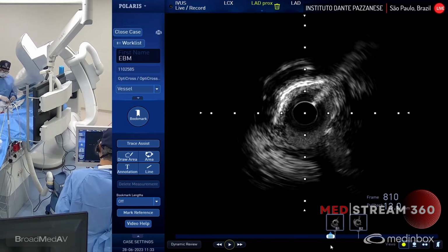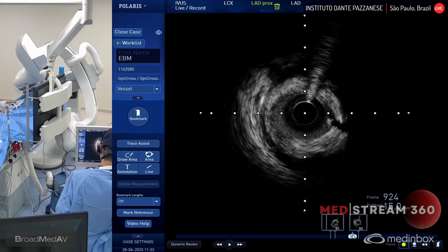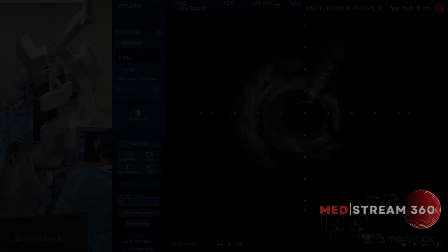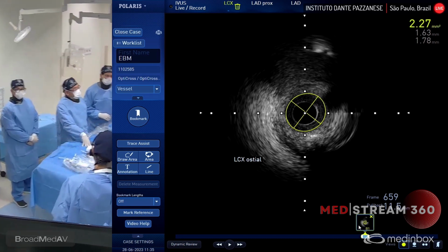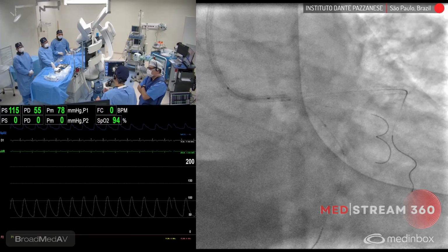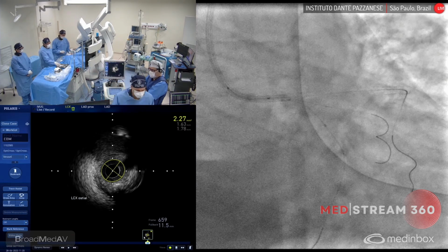And I have to say this is more disease than what appears by left main. You can see the circumflex wire coming from 4 to 5 o'clock. And this is the distal left main. At this point here, looks like to be a more focal lesion. Rodolfo, significant disease in the left main. This is very clear. Significant disease in the circumflex by both physiology and by imaging, and also a lesion that extends up to the ostium of the LAD. So what's your plan here?